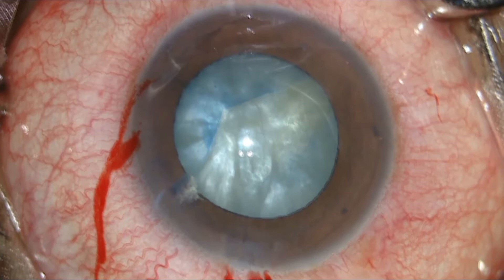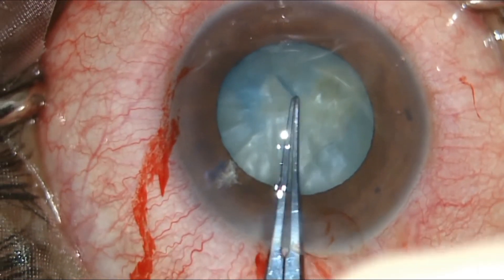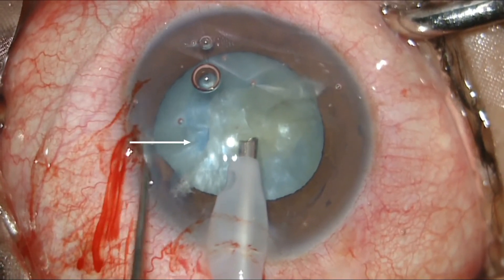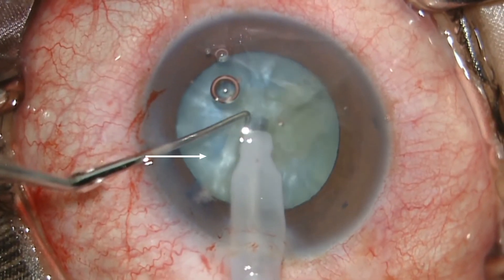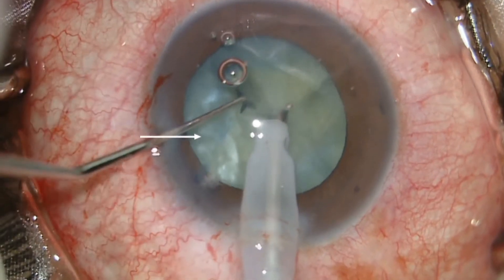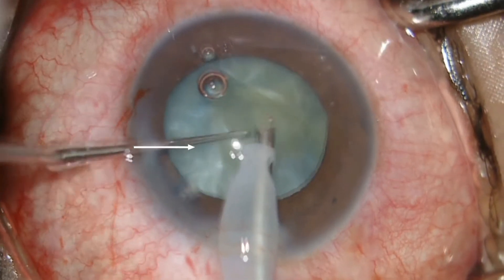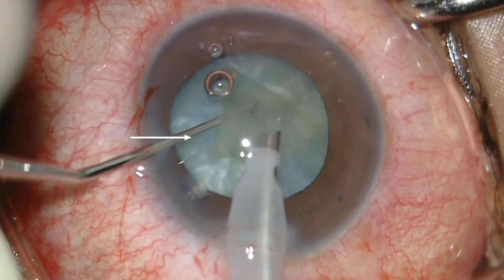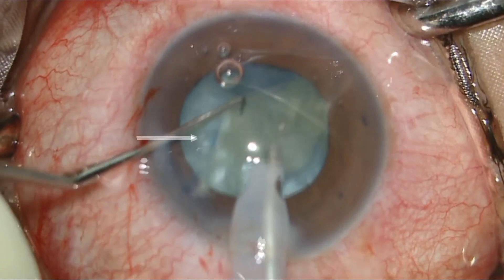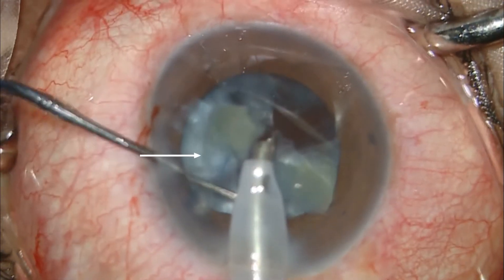In this video of anterior capsular tear having Argentinian sign and intumescent cataract, phacoemulsification is carried out using safe phaco technique. While doing phacoemulsification, vigil is being kept on the flap motility sign. The flap is fluttering and averted in nature. At no point does the flap become inverted and stop fluttering. In such situations, the surgeon continues using safe nucleus phacoemulsification techniques and looks for classical signs of posterior capsule rupture.